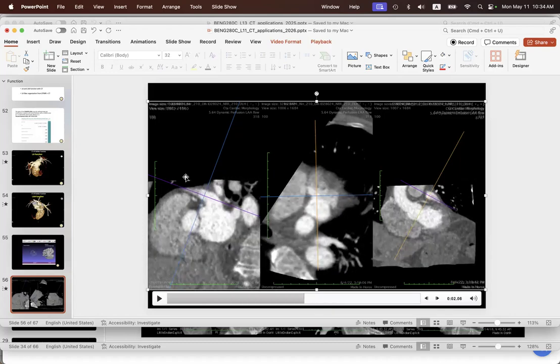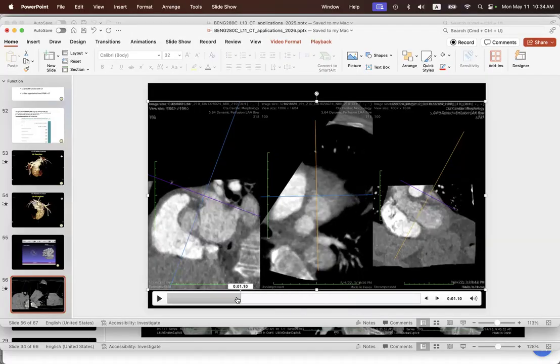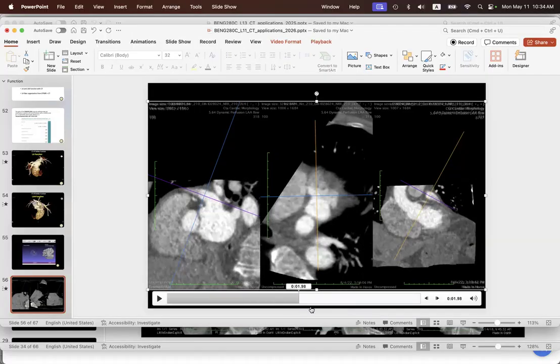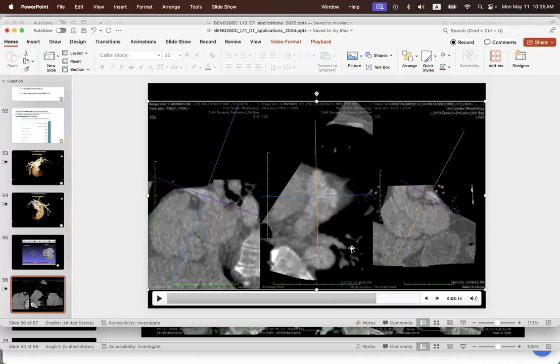And so if you look at this plot. Here, the left atrial appendage is coming up here, and we're just going to cycle back and forth in time. You can see it fill, right? It's half full, then it fills. And so now we have this estimate, and you can see it'll probably delay. It stays in there longer.